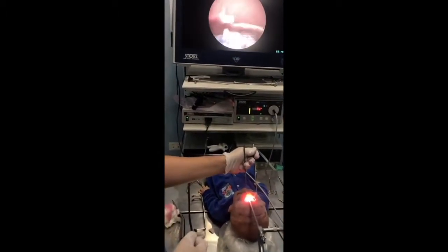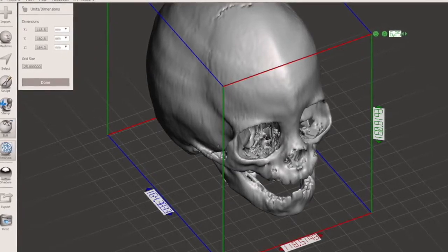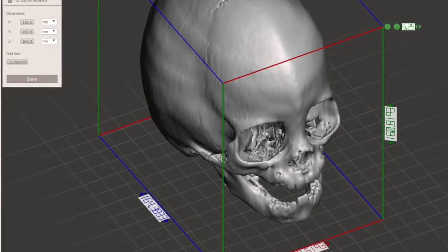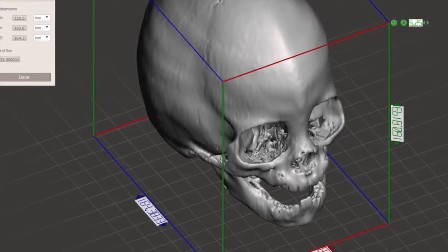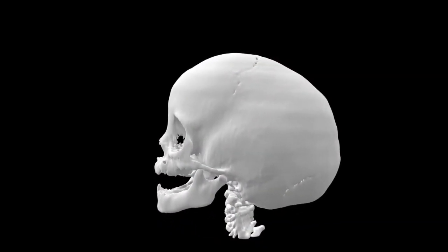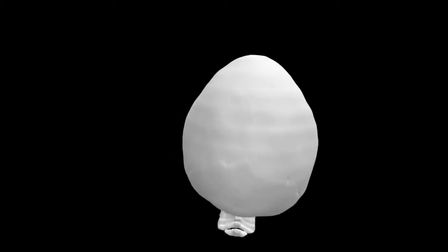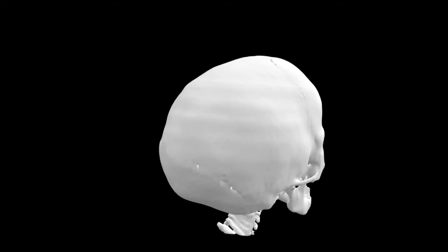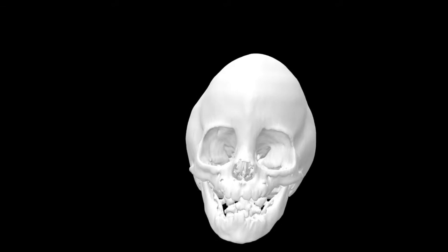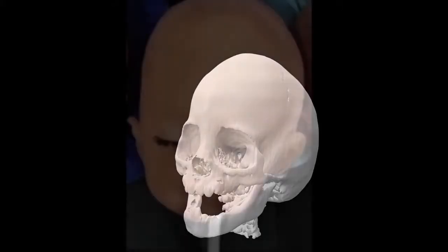The model is based on a combination of real CT images obtained from a scaphocephaly patient and a trigonocephaly patient. From the DICOM images, a three-dimensional reconstruction was created of a skull shape with both scaphocephalic and trigonocephalic features. A special resin in the shape of the skull constituted the basic structure of the craniosynostosis training module. This was complemented with a synthetic reproduction of the brain tissue and the superior sagittal sinus.